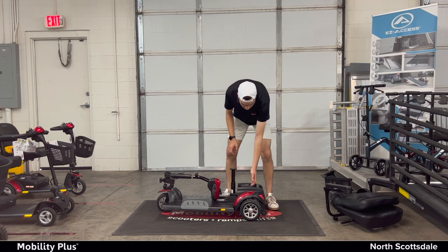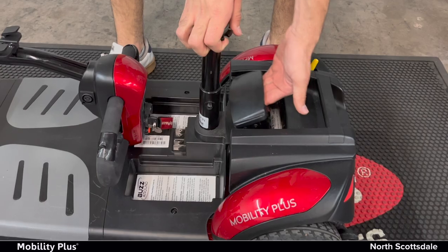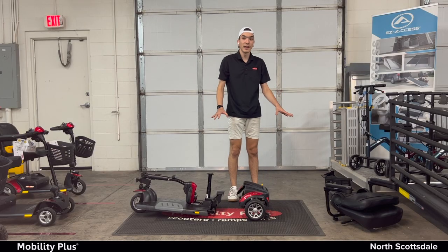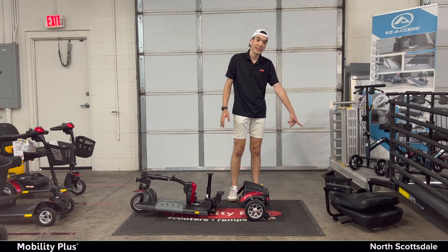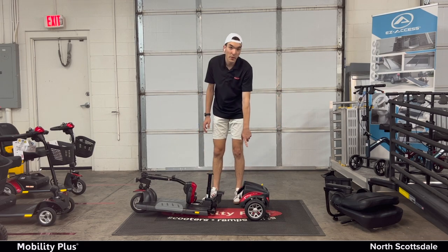Last step. There's a handle right here — hold onto this, lift the handle, and the back will pop off from the front. That's five pieces: you have the basket, the battery, the seat, the front piece, and then you have the motor.